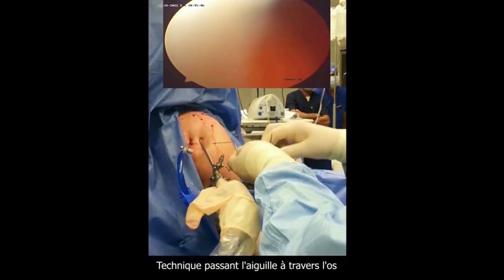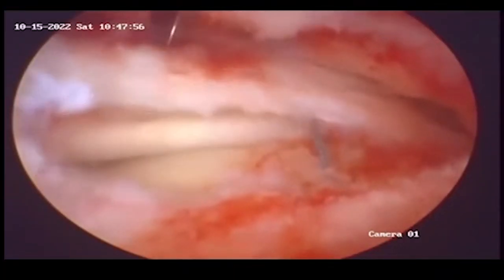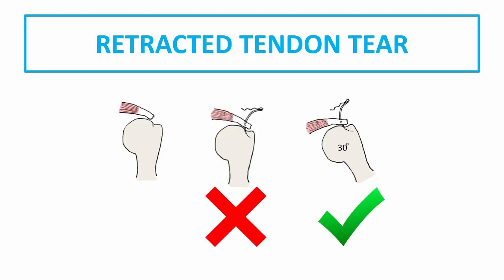The two suture ends are held with a clamp, and the second giant needle is passed through the skin, through the bone, and pushed inside. By putting the needle in the tendon, and before putting the tip of the needle in the hole, the arm is slightly abducted in 30 degrees to avoid tension on the tendon with the needle by pulling it laterally. And then the needle is pushed through the bone.